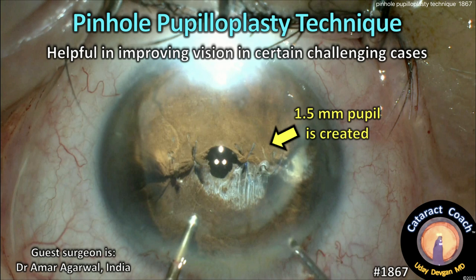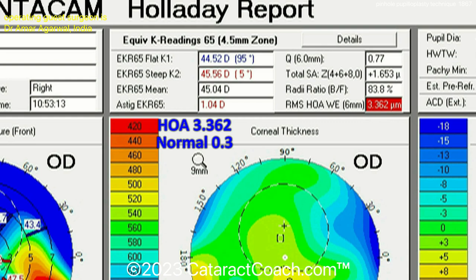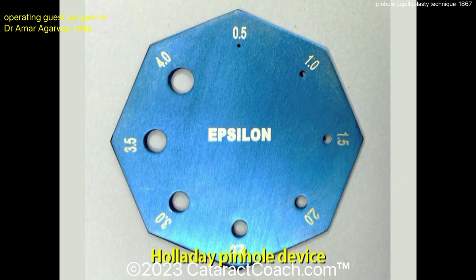CataractCoach.com presents the pinhole pupilloplasty technique, which is very helpful in improving vision in certain challenging cases — especially cases like this one: a patient with pellucid marginal degeneration who had a tucked-in lamellar keratoplasty done years back. The patient counts fingers at one foot. See the red box there? There is a huge amount of higher-order aberrations in that cornea — a very irregular cornea.